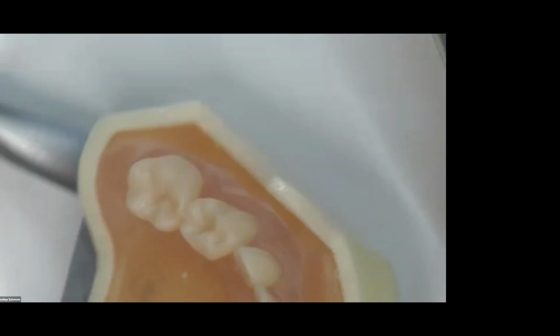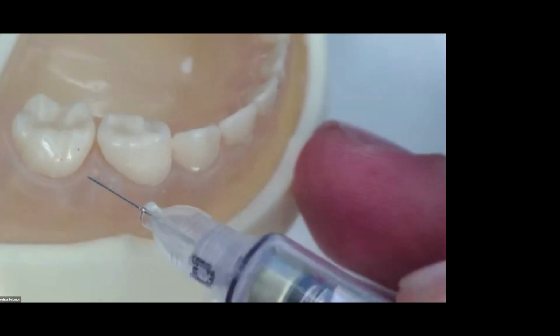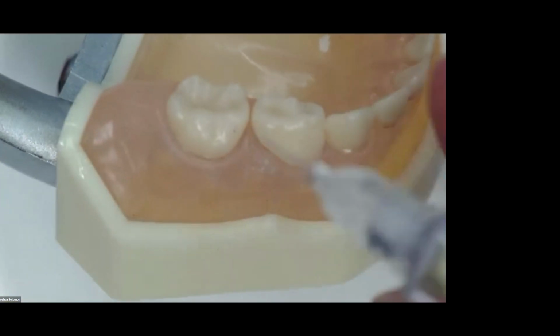So first stage, number one, for my sew-in, I want to make sure that my light and the D is aligned in the same angulation. I need to be able to see both. So if that D is rotated around, I'm not going to be able to see my light. So please make sure you ask your teams, don't over tighten your needle here. So I have my D and the light in the same orientation.